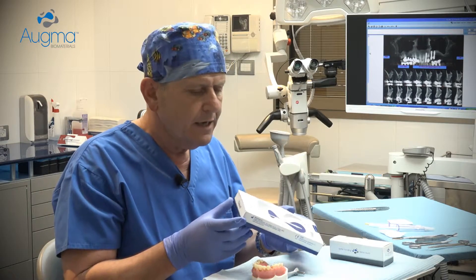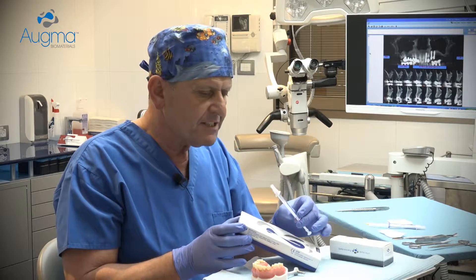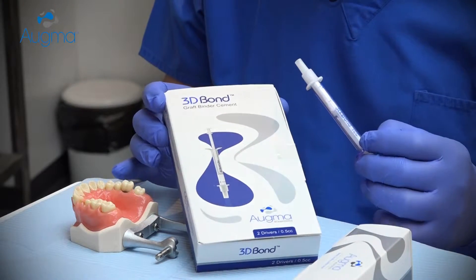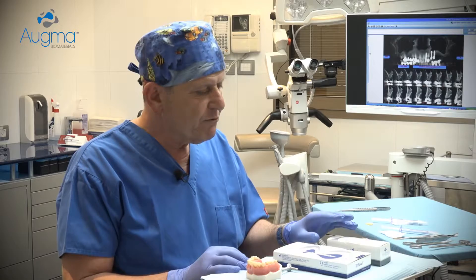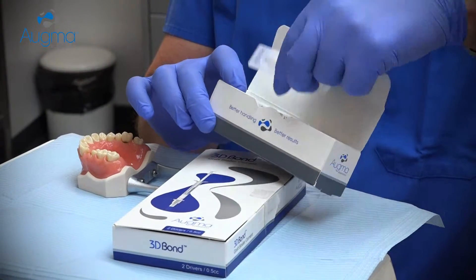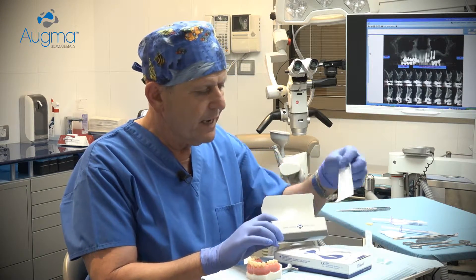3D-Bond comes in two different packages, in two different sizes. One is of half cc, two syringes in a box, and the other one is of one cc, two syringes in a box. Together with the kit, we provide you an application kit which contains two vials of sterile saline, a needle and a syringe.